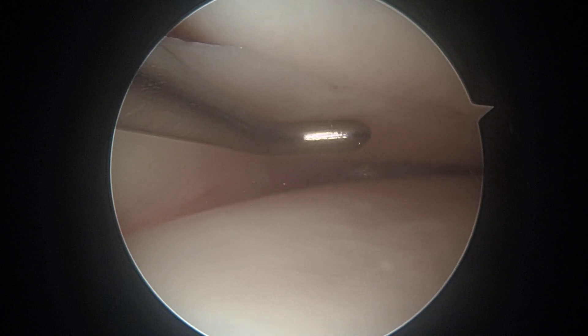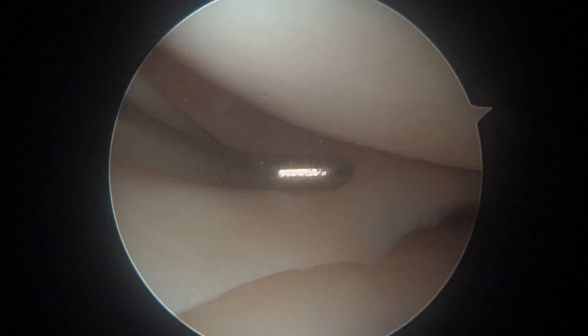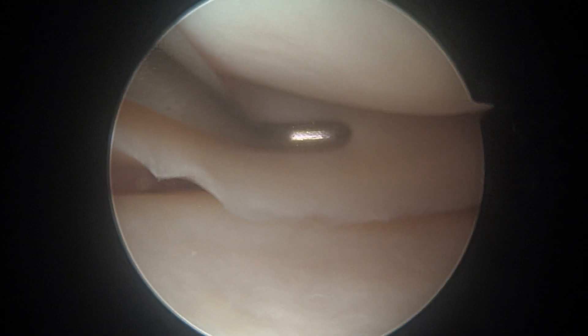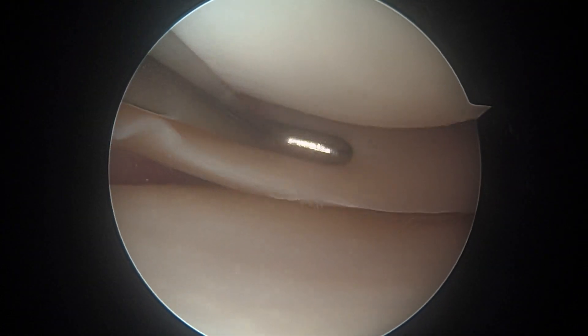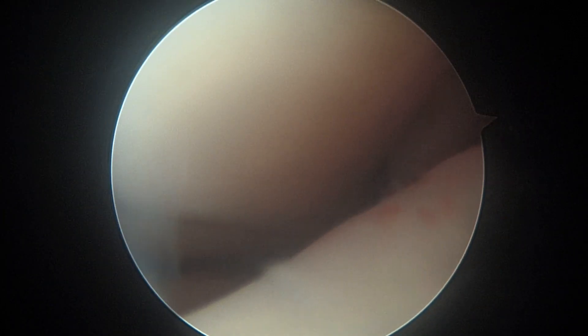Your ACL tear is going to be over here to the right — we'll look at that in a minute. But right now we want to look at this meniscus. We'll take a probe and have a look. We didn't see any significant meniscal tears on the MRI scan, but we always double-check. This looks good. We can look all the way back to the root, way over here. As I hook it both below and above, that feels pretty stable.